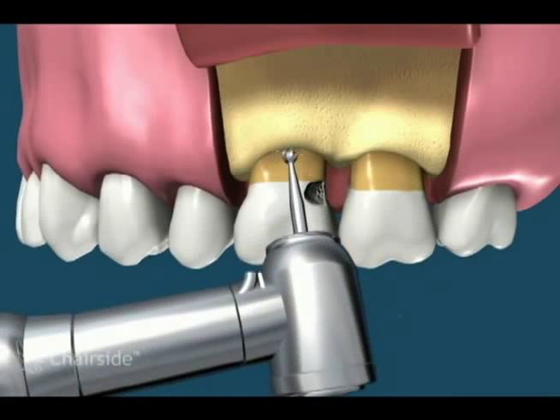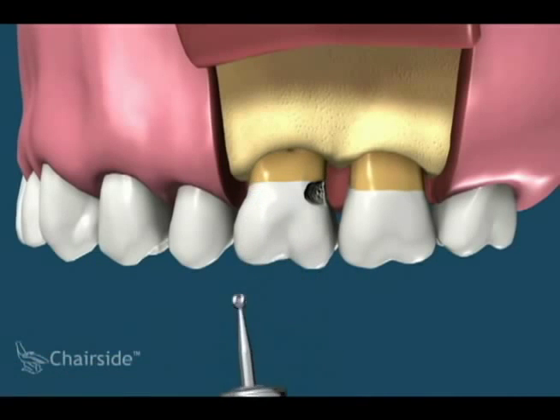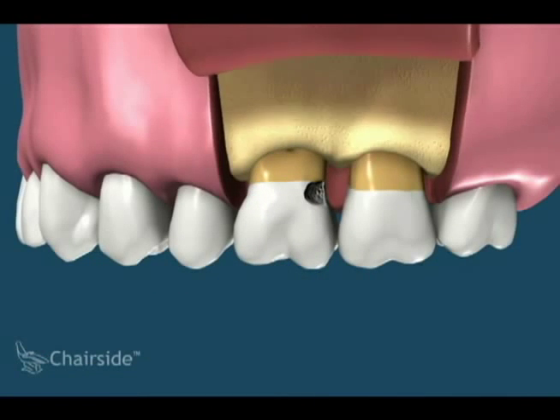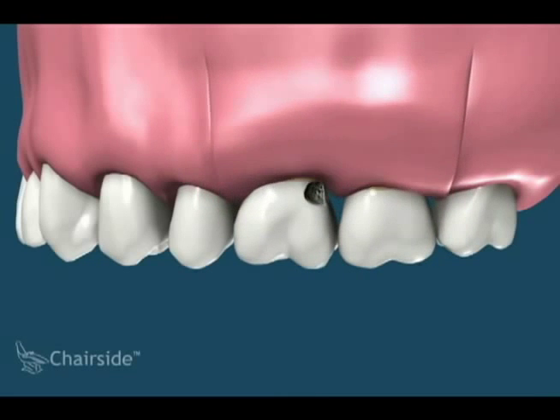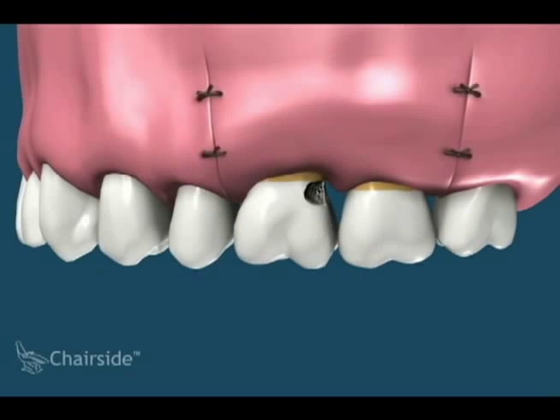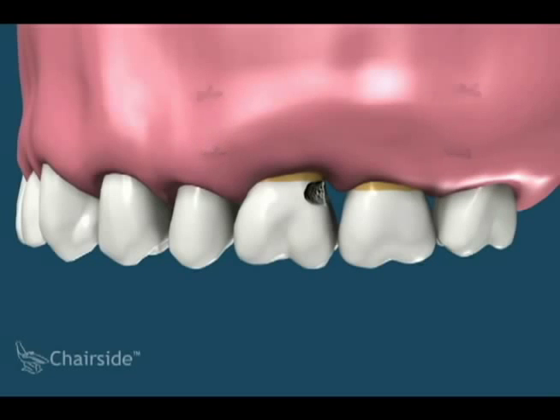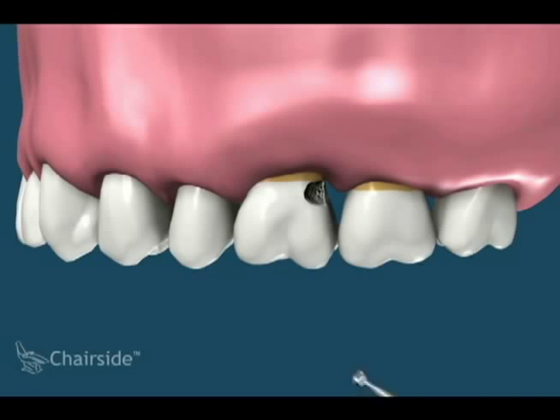The new bone topography must follow all the previous peaks and valleys. The gums are then repositioned on the prepared bone, which now supports the gums below the cavity. The cavity can now be accessed.